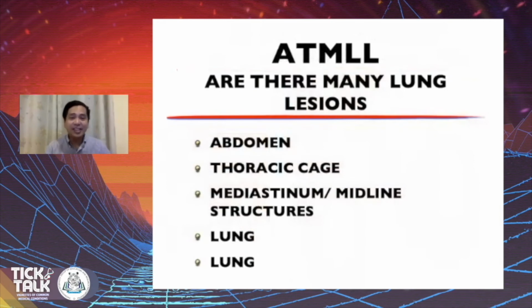Okay, so after checking if the X-ray is acceptable, we have the 4 P's again. Take note of that. Let us now proceed with how to examine and interpret the film. There are different ways we can approach this. We have ATMLL, we have the ABCDEF. But I will be focusing on this one, because this is what was taught to us when we were in med school and in residency and fellowship.